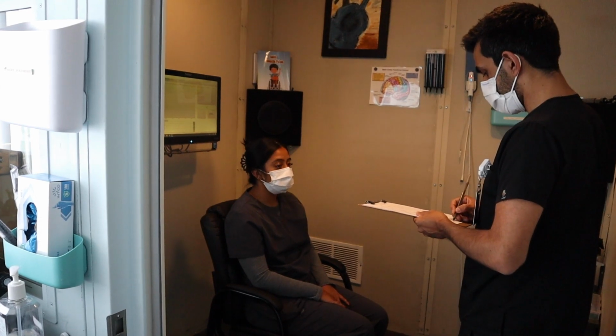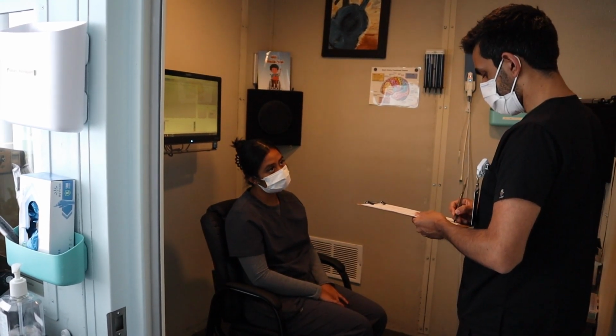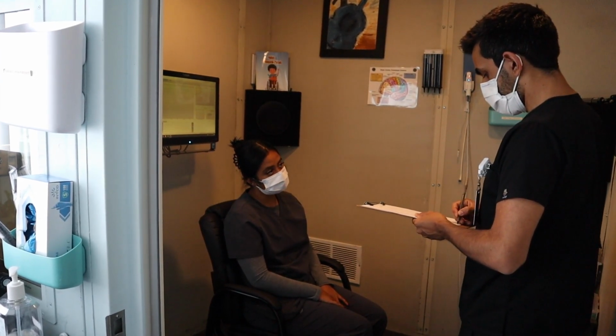Even if a patient claims that they don't have hearing loss, which we do hear a lot, I would ask something like, do they feel like one ear hears better than the other? Because sometimes, even if you're hearing okay, one ear is doing more of the heavy lifting than the other. These are all things we like to find out before we get them into the test.